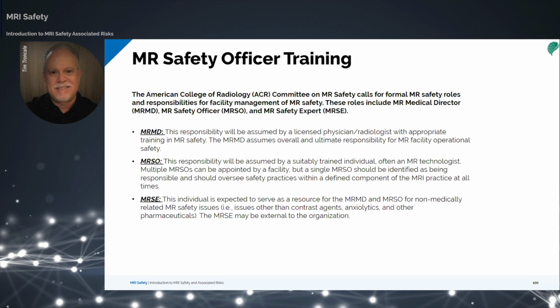And then the last, as mentioned earlier, the MRSE, the safety expert, is typically a physicist. They provide assistance to the MRMD and MRSO for non-medical issues. And as I mentioned earlier, it can be, and typically is, external to the organization.